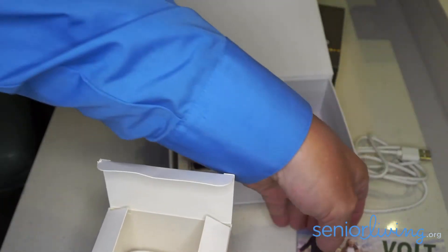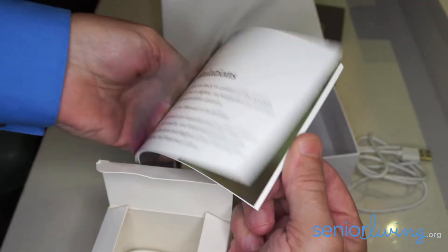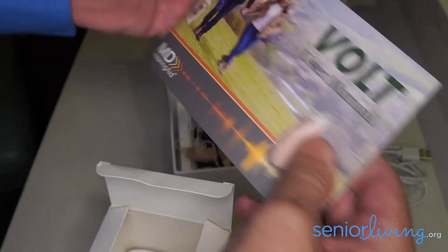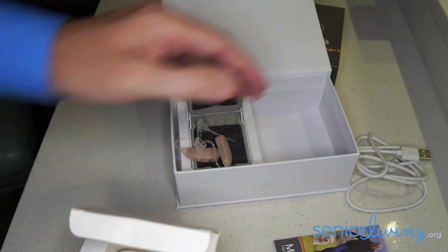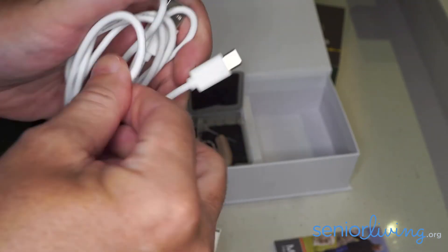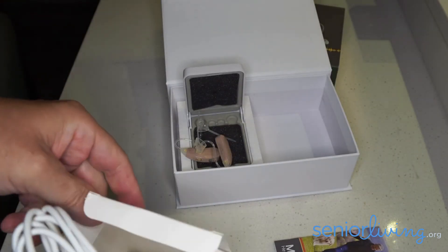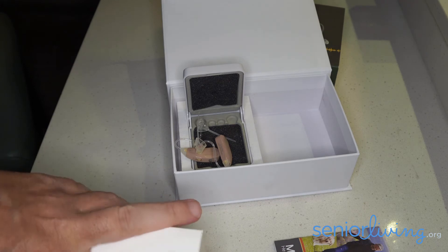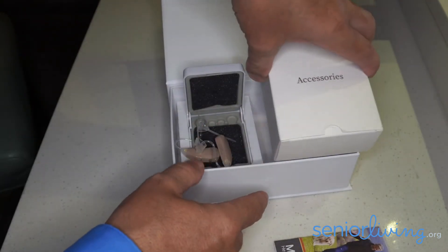The user manual that comes with it is quite easy to follow. They also have a really good online version of this, and you can also talk with one of their audiologists or specialists online. MD Hearing Aid is a nice alternative in terms of cost, and it also provides an alternative user experience to going to a local provider.